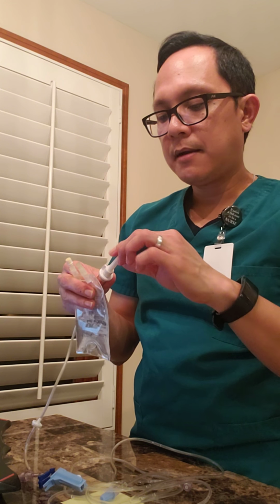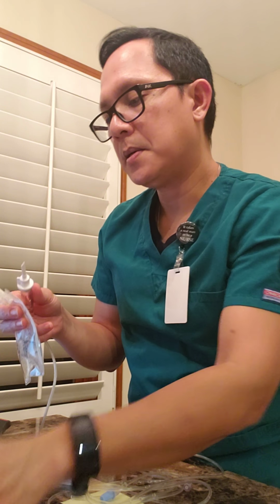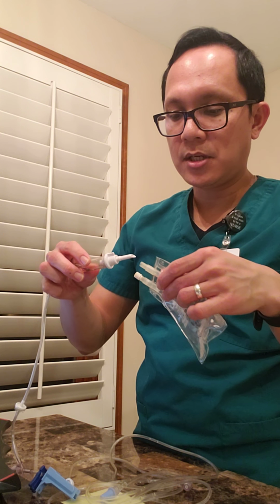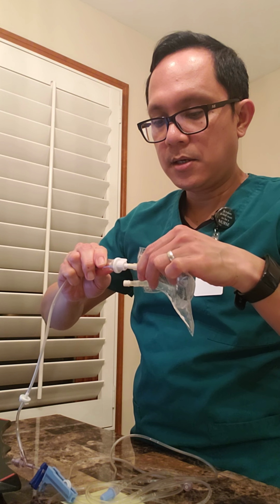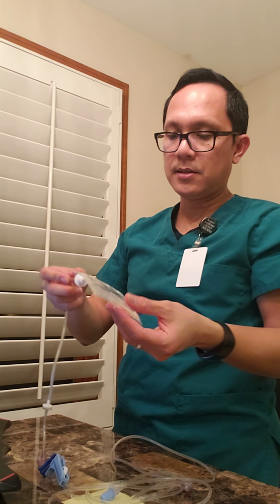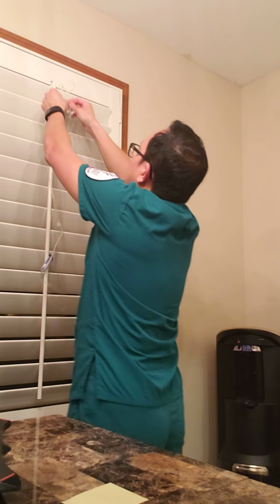I'm gonna carefully take the lid or the protective cap off my spike, without contaminating the spike by touching it. I'm gonna slowly insert it in the port of my IV bag. Once that's inserted, I'm gonna hang the IV bag on the IV pole.